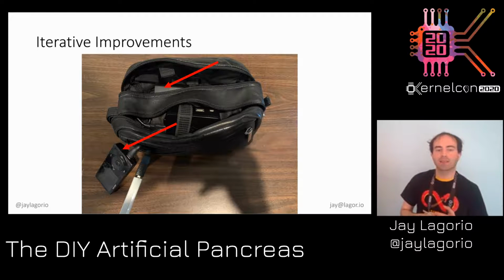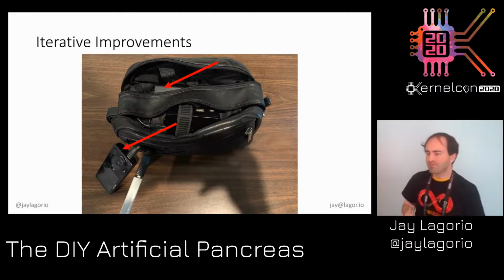And the difference between the two is that the newer one, the one that I just held up, its data structures are slightly different. So from the time that I got it and opened it up to, I think it was about 8 hours later, I was able to reverse engineer the data structures and get them working with OpenAPS. Because at the time, there was no way to read directly off the Bluetooth.